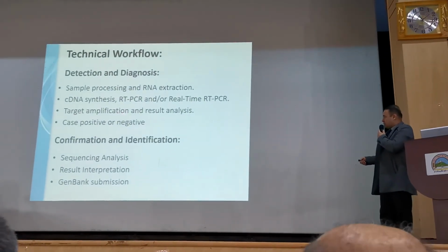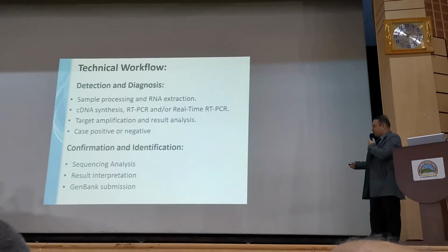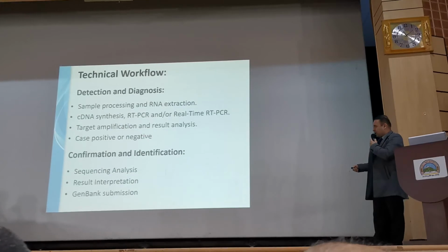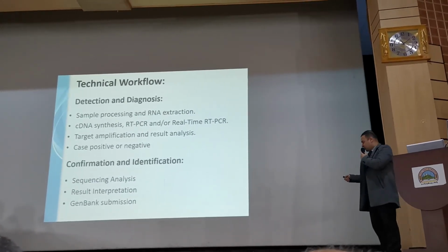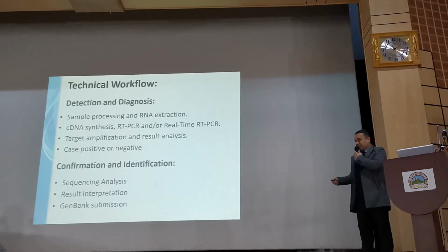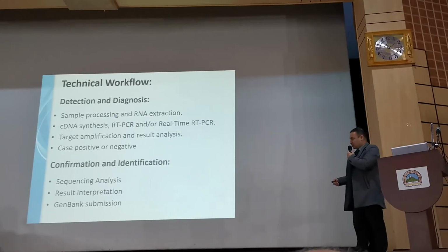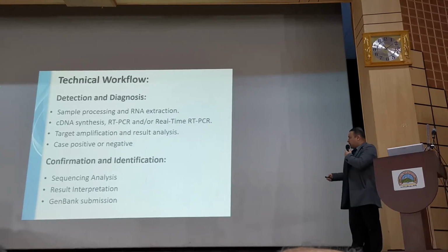So targeting the amplification and result analysis after this amplification, and then declaring whether the case is positive or negative. And as my previous talk said, this is very important, because this molecular approach can detect the virus even if it is in its incubation period and in the very first day of infection.